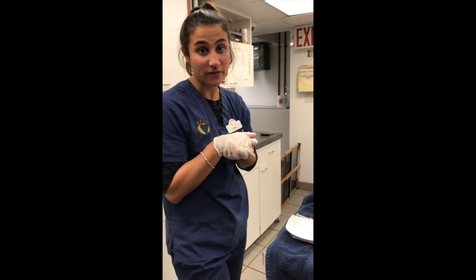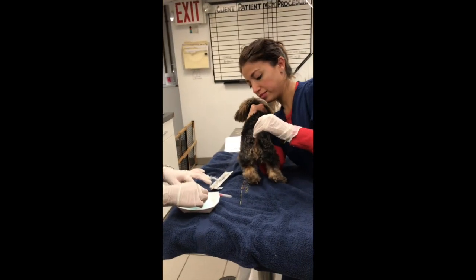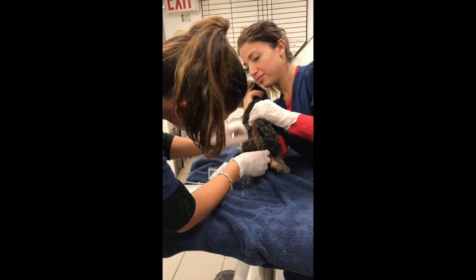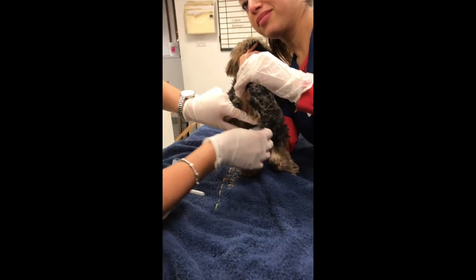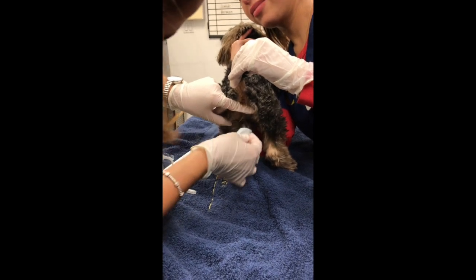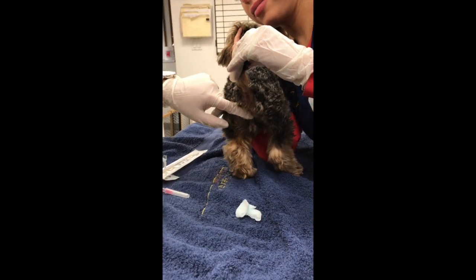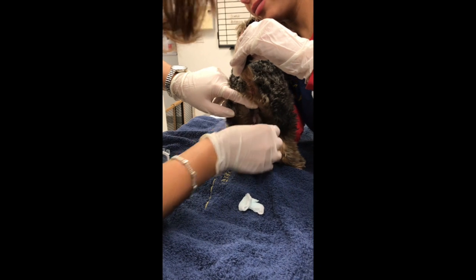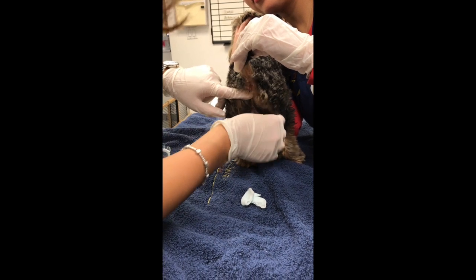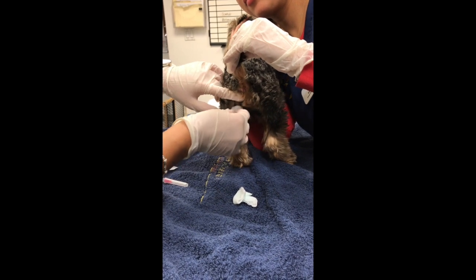Okay, so today we're going to be doing a vaginal cytology. The first step I'm going to do is clean the vulva. I have some diluted chlorhexidine here. I have Rachel holding the tail for me, which she's going to keep up during this entire process. Just going to really try to get all the hair away. This dog is not spayed, so today we're going to be taking a look at the epithelial lining of the vagina just to see what stage of estrus she's in.